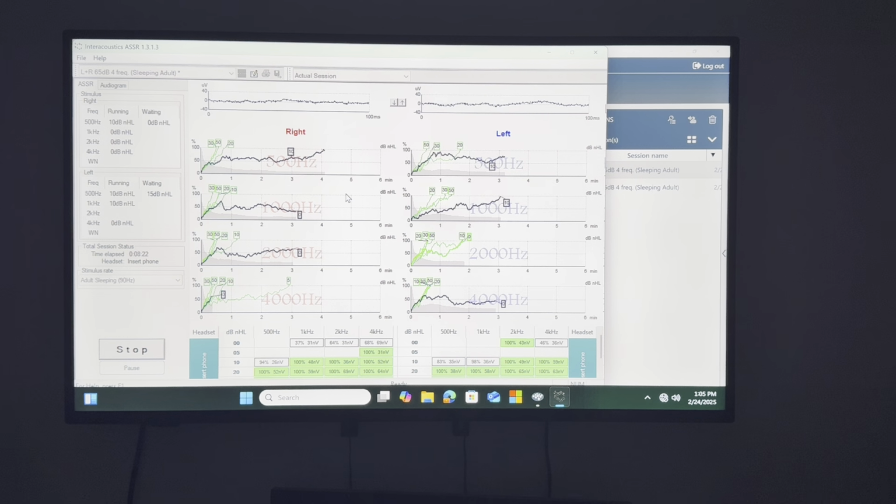I think there was one research study which showed 28 minutes or 24 minutes, I don't remember. On average it took 24 or 28 minutes to test an infant. That seems like a long time, doesn't it? It's pretty long. I thought this was supposed to be faster. Well, compared to ABR, it is so much faster. I think it depends on the EEG level being quiet. It all depends on the EEG, if somebody has really low EEG.